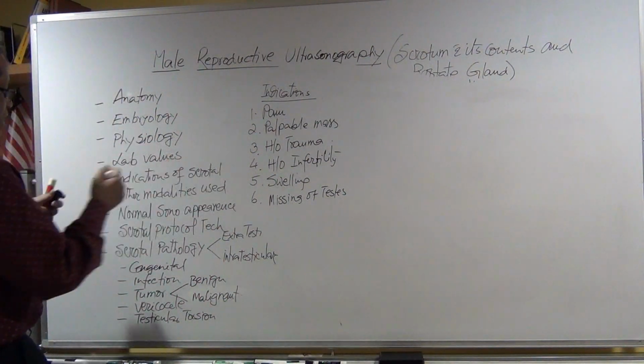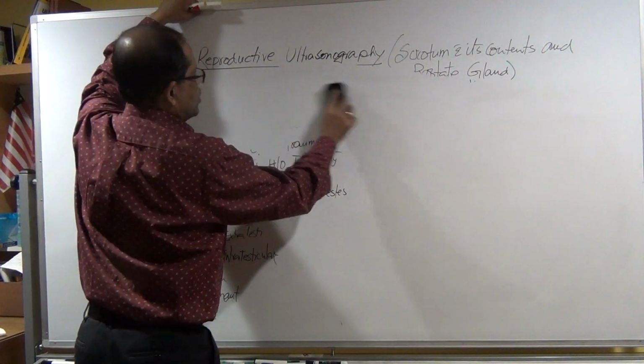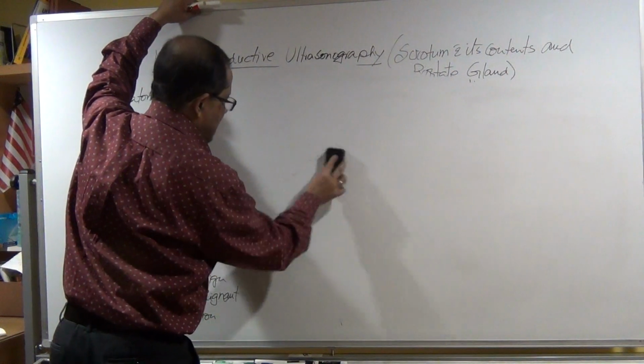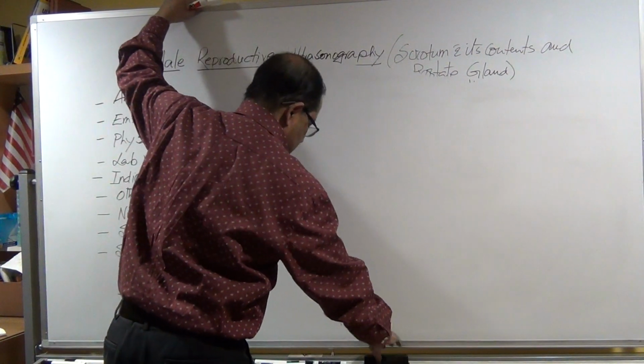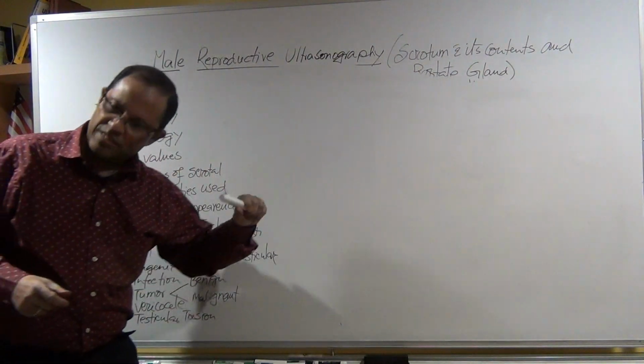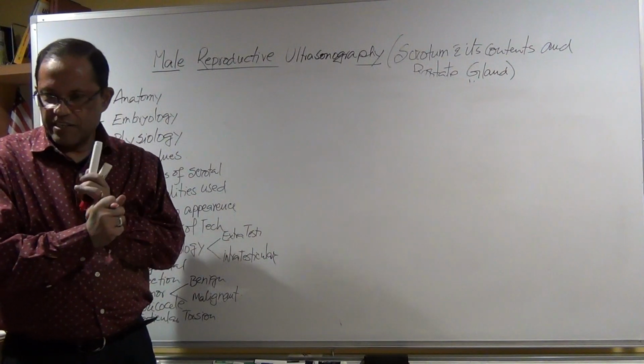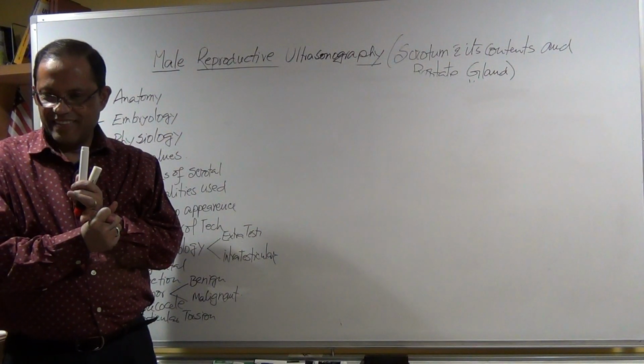Then what are the other modalities for the scrotal evaluation? Keep that in mind, it is the testis. Scrotum means testis. Make sure I don't want to use radiation. Right?